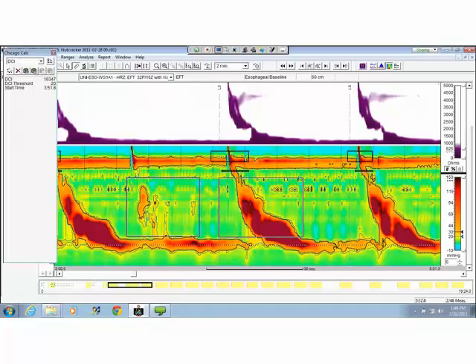We have about 5 more minutes if anybody has any further questions. Wendy, or if I can demonstrate anything. Wendy, yes, quick question. Sure. I think I have 2 patients, when they swallow, there's like a delayed peristalsis. How do you measure those ones? It's beyond that 20 seconds measurement. Like nothing happens and then 21 seconds later something did go down.